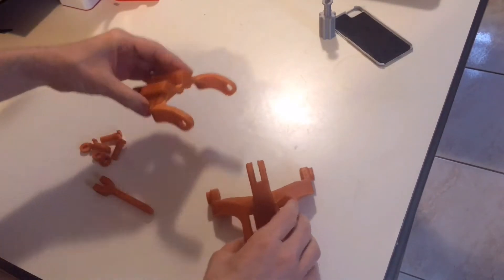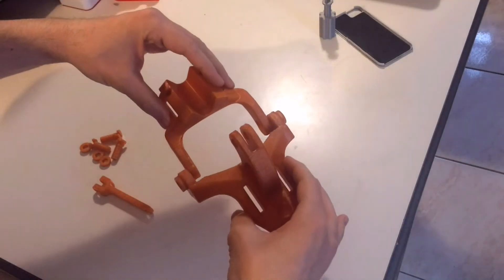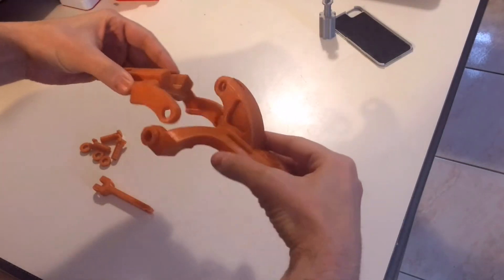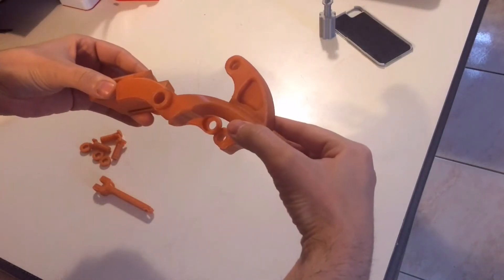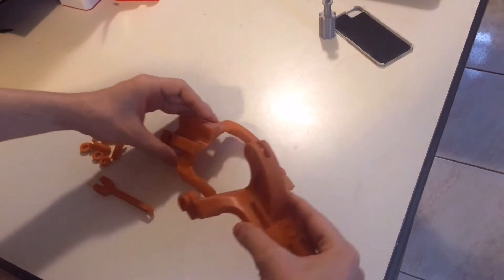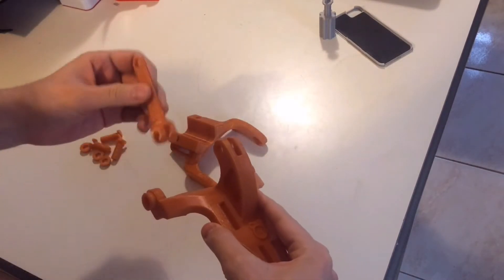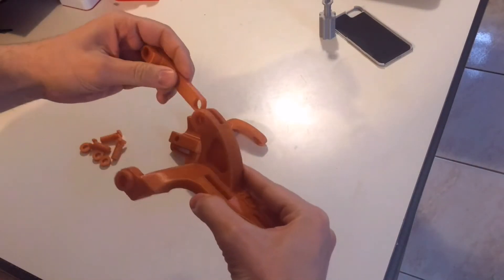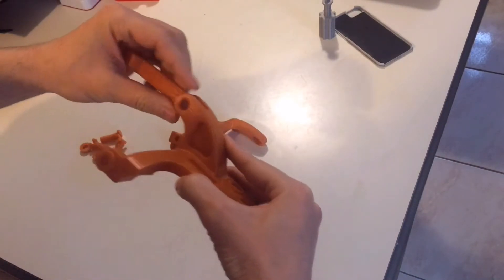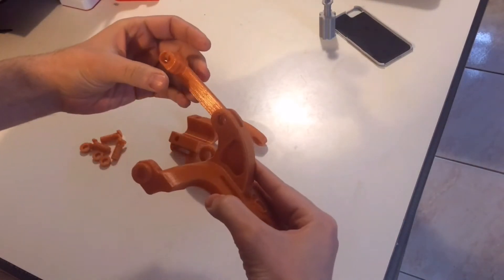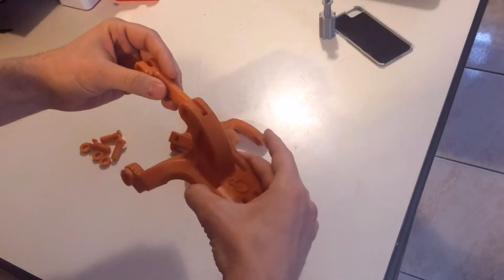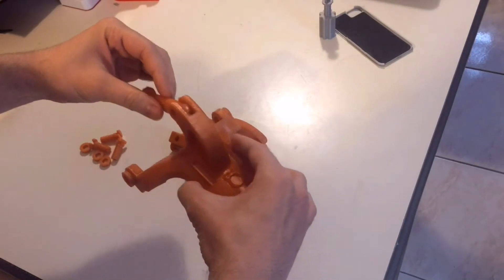Anyway, this piece will connect like so. And this piece will go here. Okay, so I'm going to put all this together, and then we'll go from there.